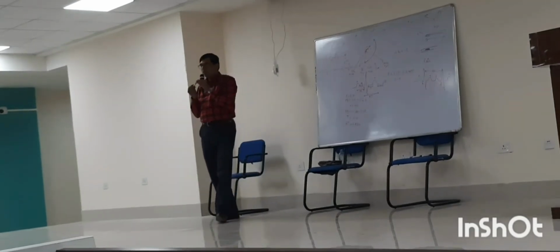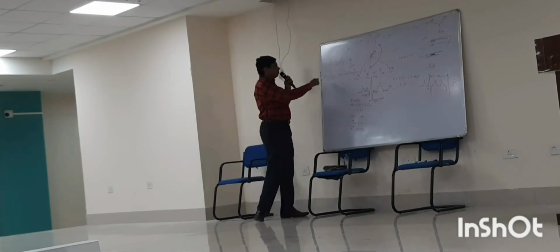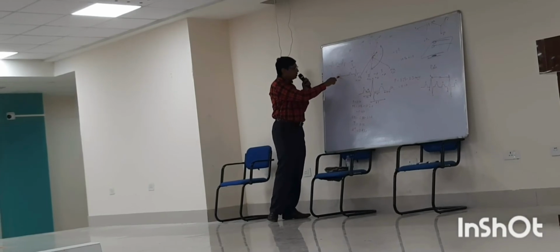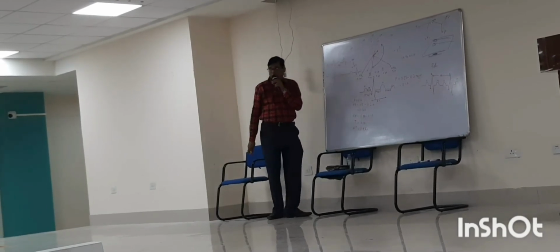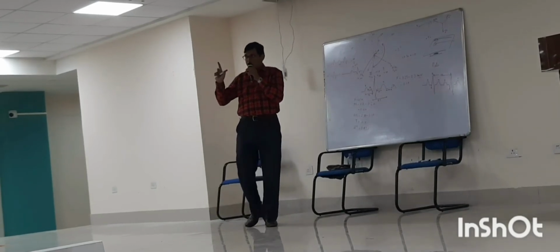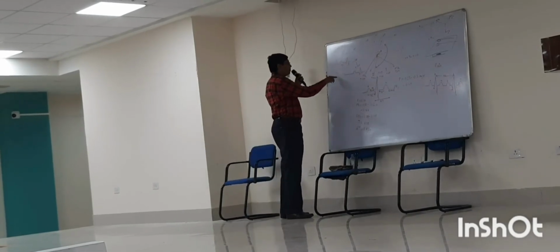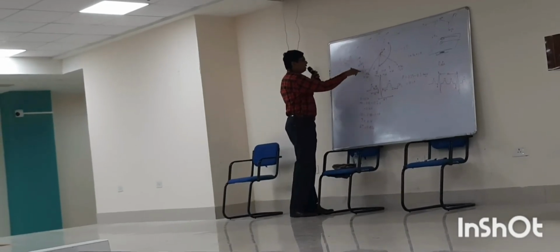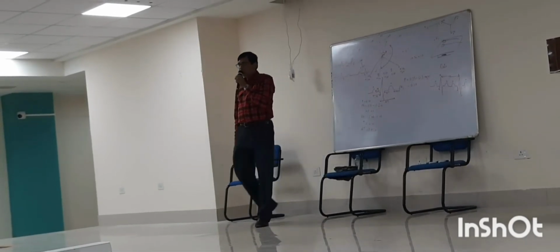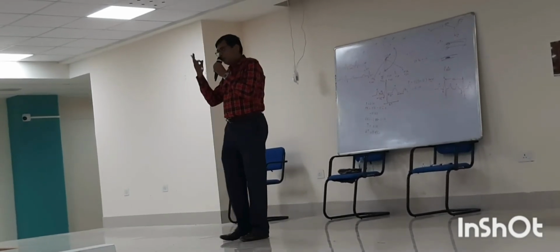Now look, PR is prolonged. A PQRS complex is followed by a P wave which is not followed by a QRS wave. That is, the ventricular beat is missed. That is the block, second degree block. If it is alternate, P wave, no QRS, PQRS, P wave, no QRS, then it is 2:1 block. If it is every 3 beats, it is 3:1 block.